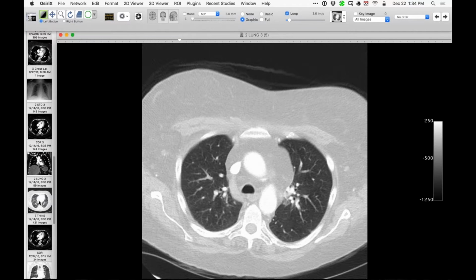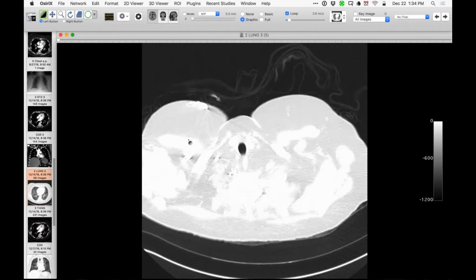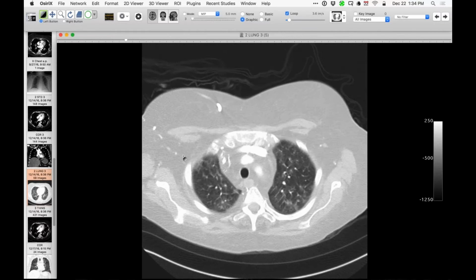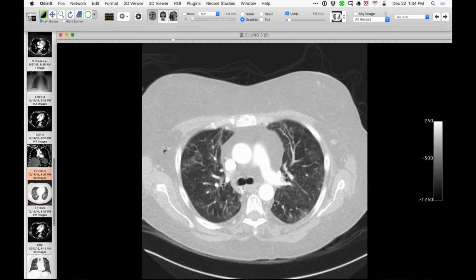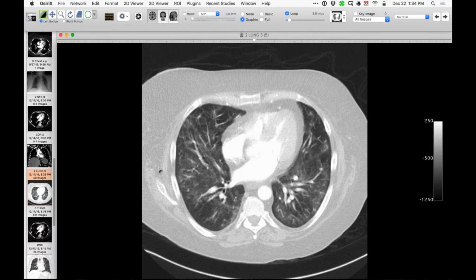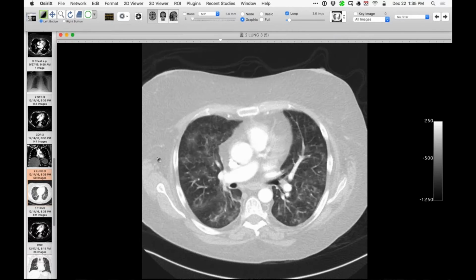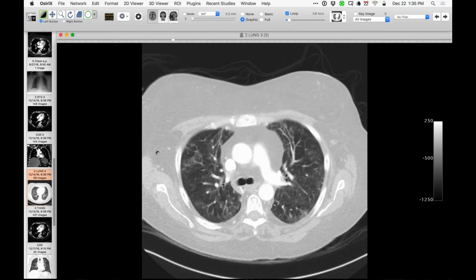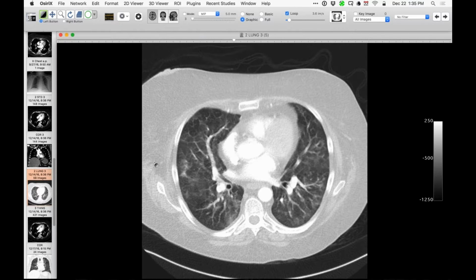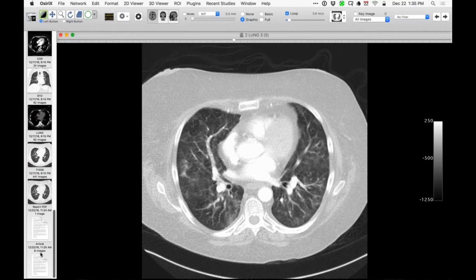She came back more recently now, so this is December, and now you can see pretty much the same thing now that she had in April. It's the same phenomenon. Again, no signs of infectious bronchitis or bronchiolitis, no pleural fluid. It looks very much the same. So I suggested that she just has maybe a recurrence of the same phenomenon, which may be a form of, call it steroid responsive, GVHD.